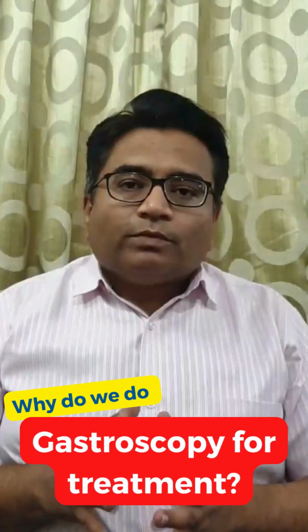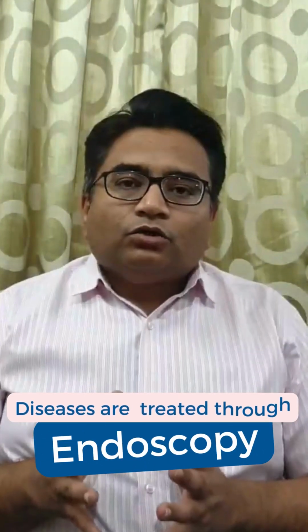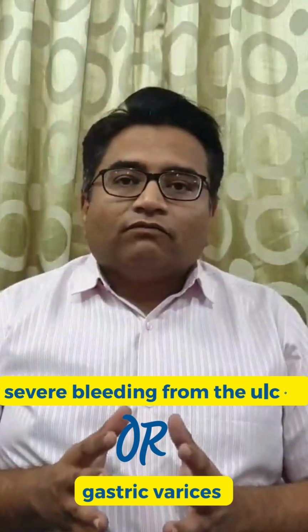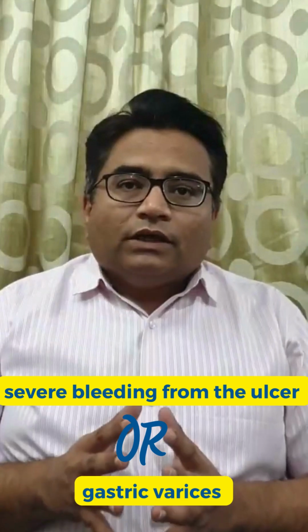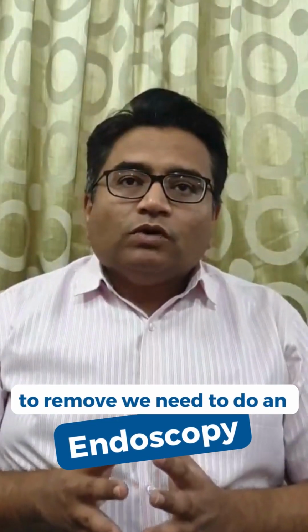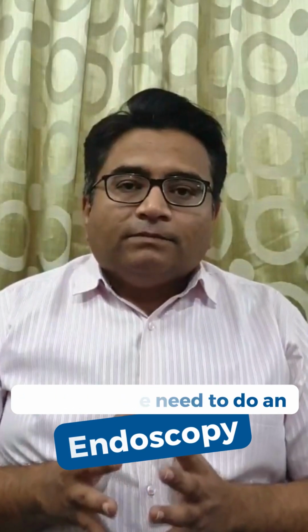Similarly, why do we do gastroscopy for treatment? So certain diseases are treated through endoscopy, like if there is severe bleeding from an ulcer or the gastric varices, or somebody has swallowed a foreign body like a coin. To remove those foreign bodies, we need to do an endoscopy.